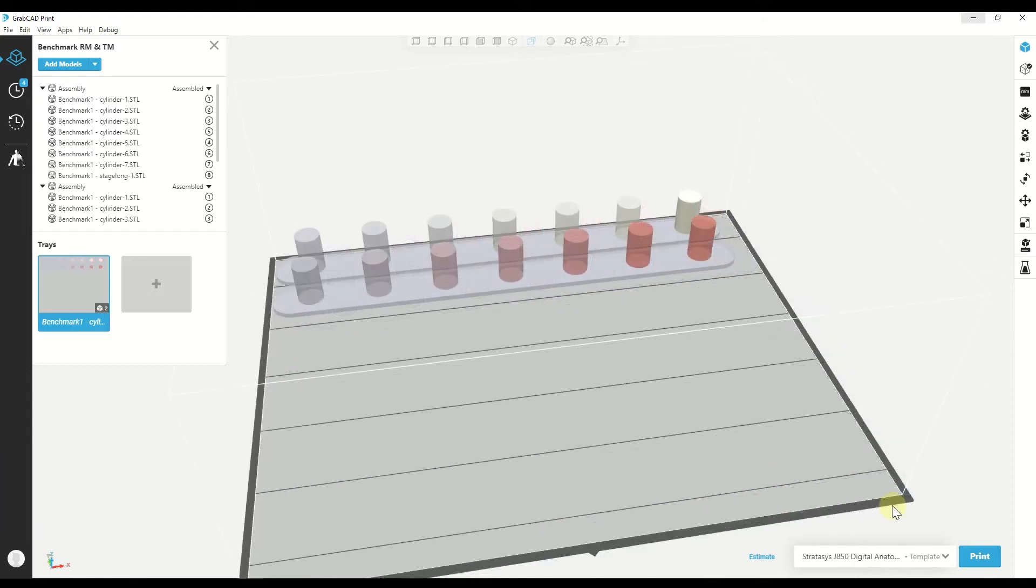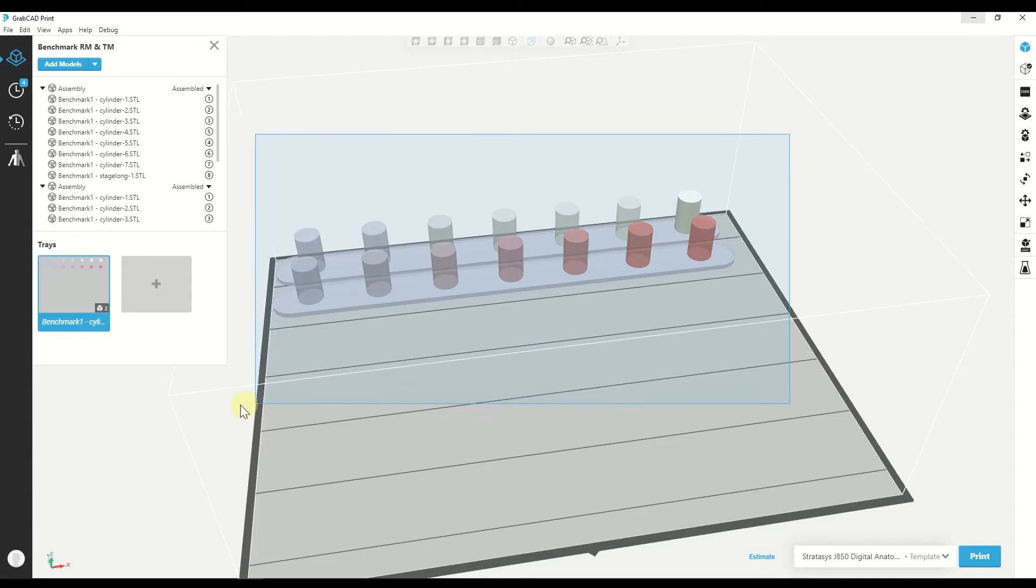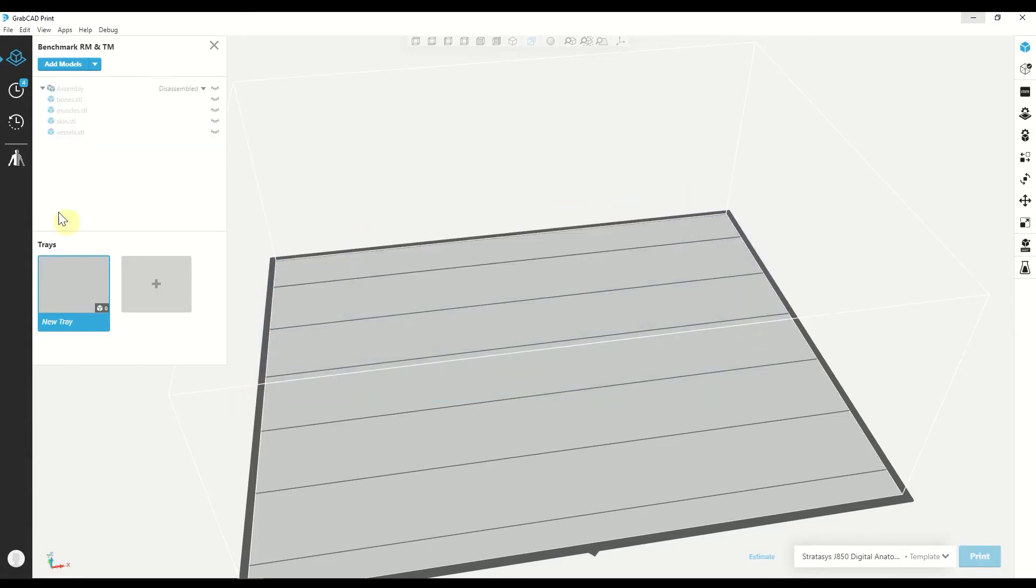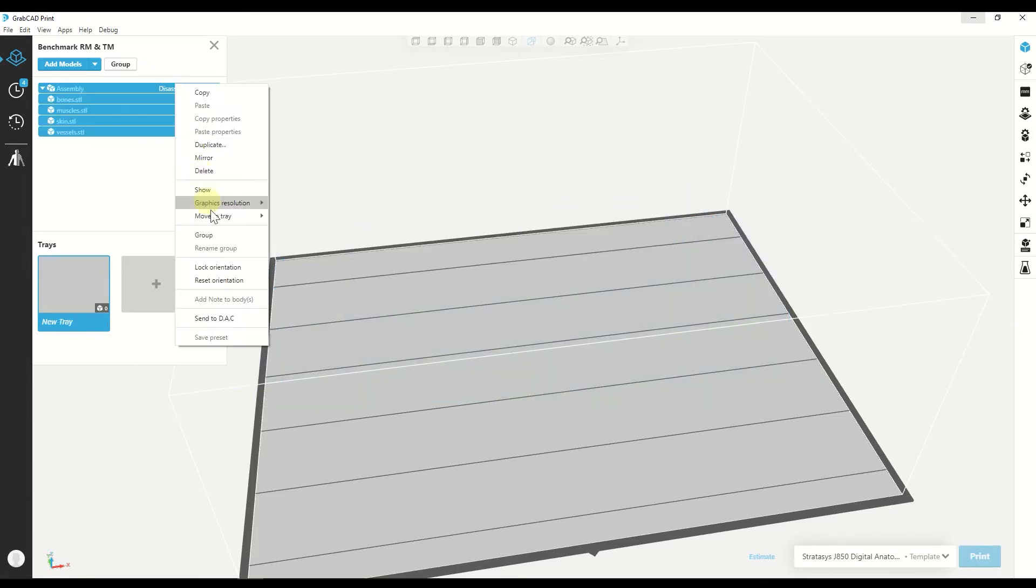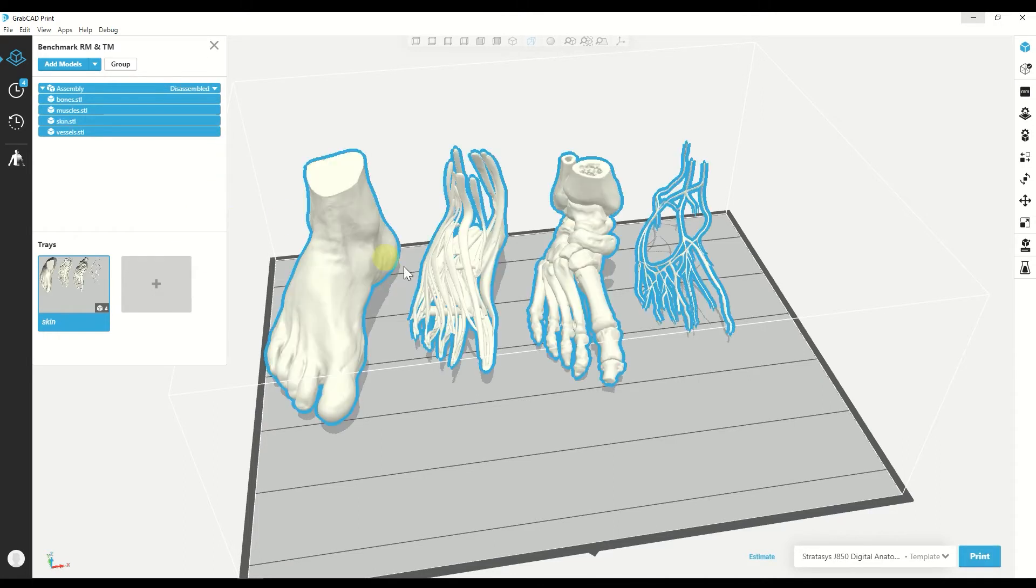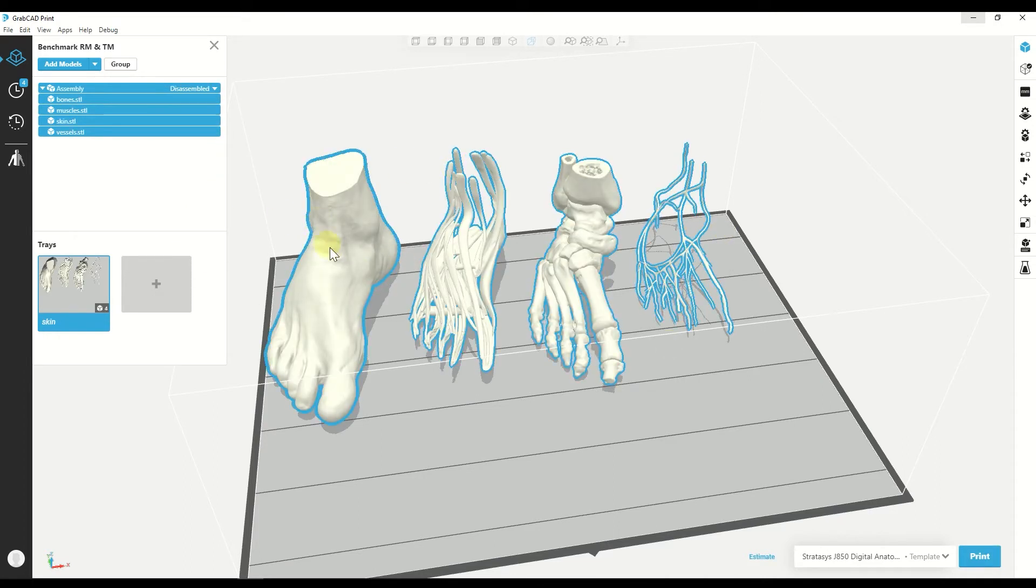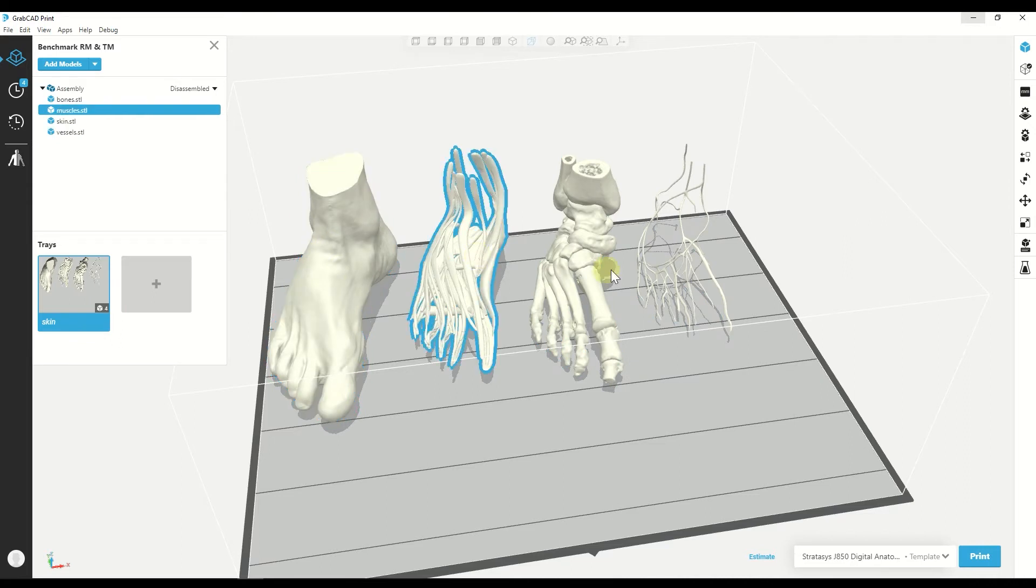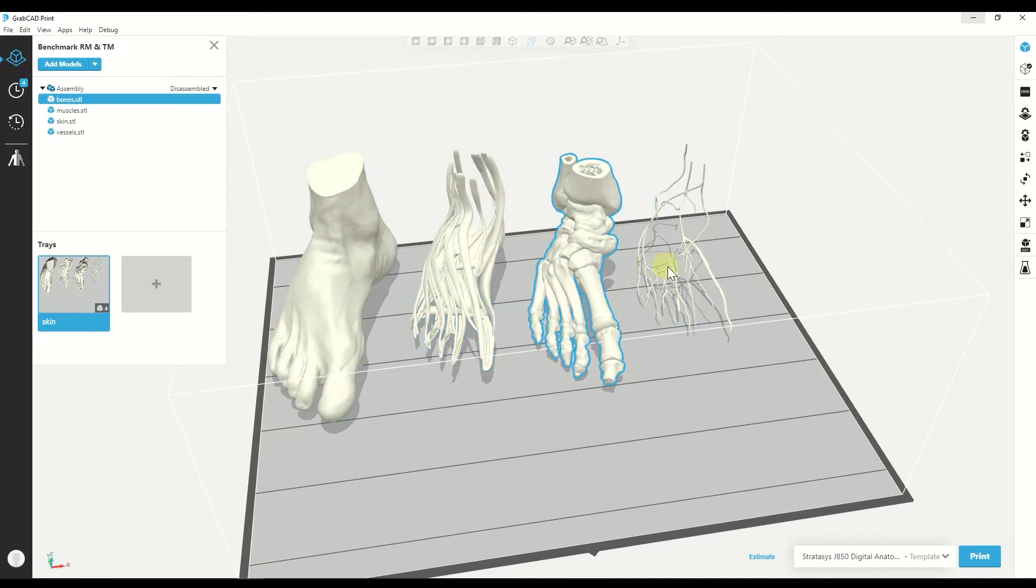So let's see how to use the Radiology family. For that we have a foot model that we are going to use. We have four parts: the fat tissue, the muscle, the bone and the vessels.